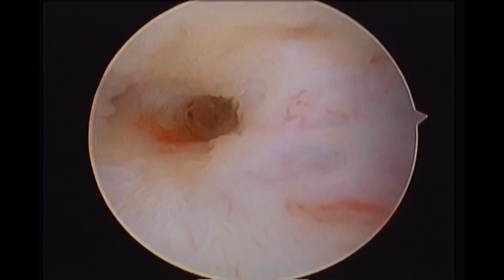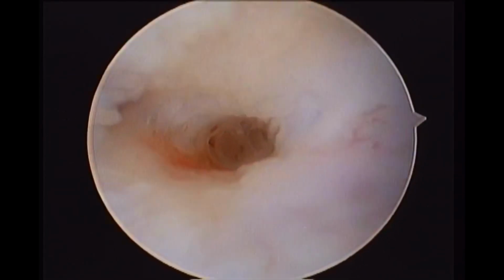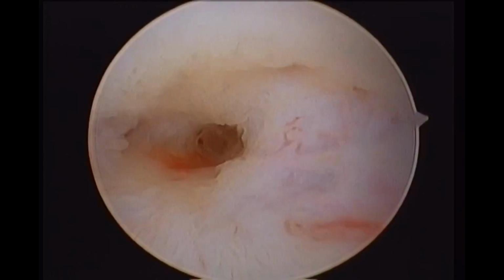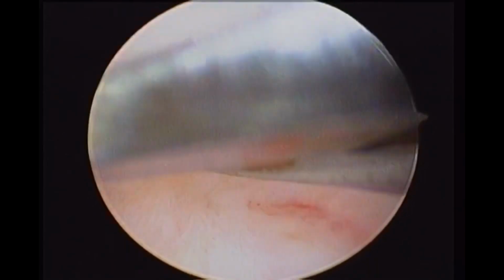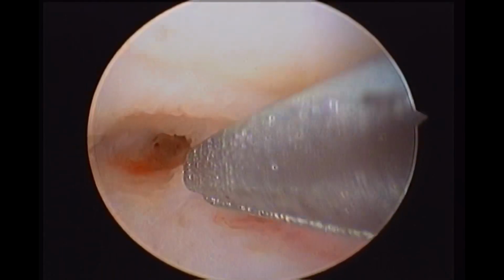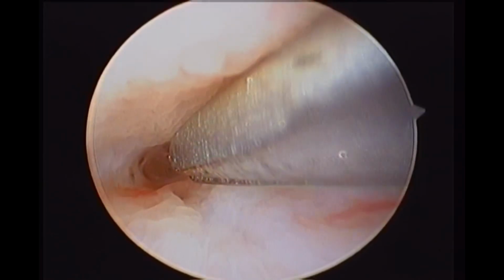So the start is very frustrating. There is no opening. There is no black hole appearance to tell you the entrance of the cavity. The internal os is totally obliterated, and there is evidence of a false track on the left side done by a previous surgeon. So here I bring to you a very nice and useful tip.